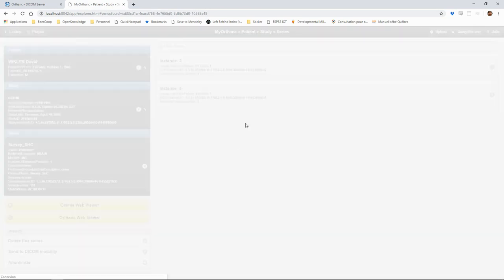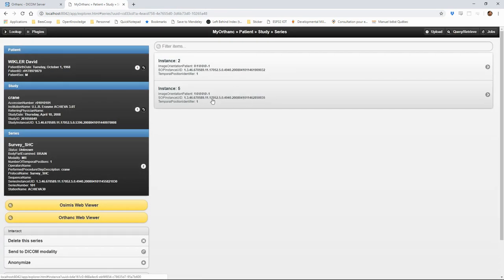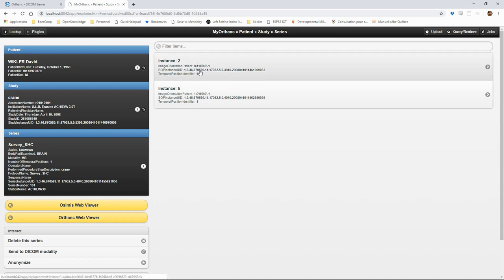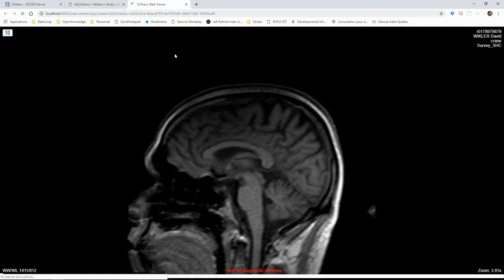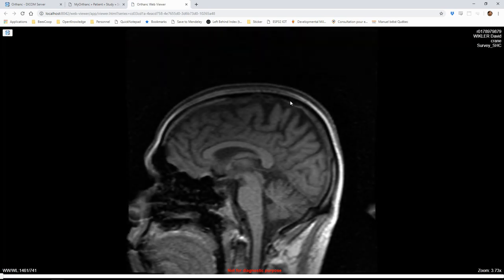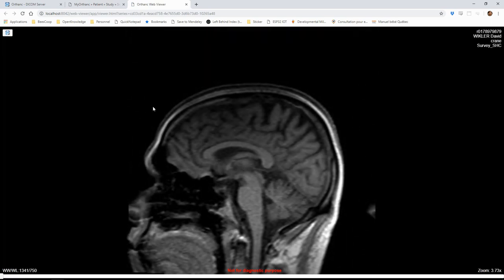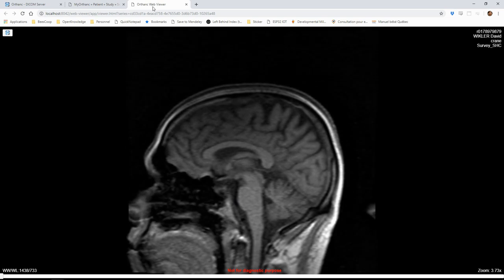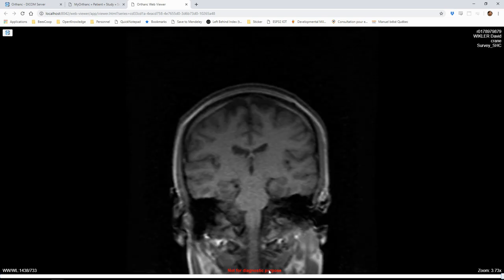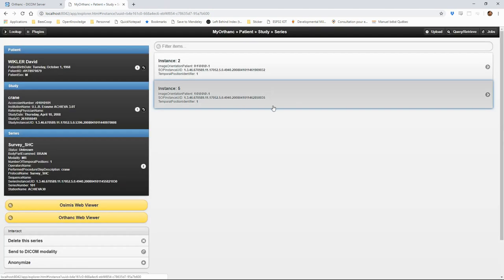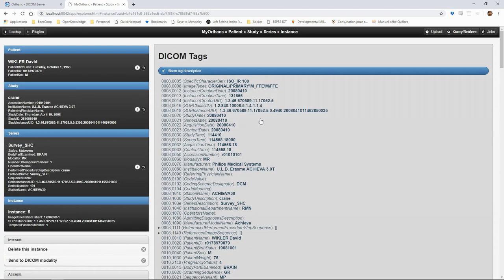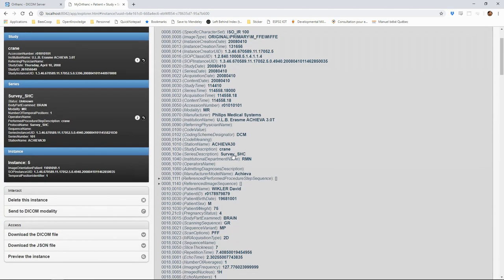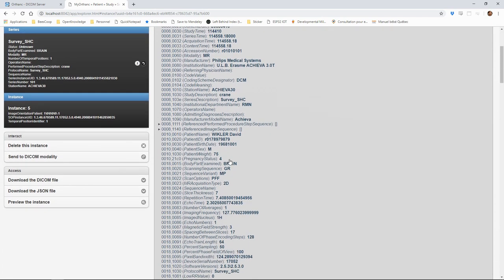At the series level, we also have access to the more basic Orthanc viewer which has less functionality. At the instance level, we can see all the DICOM tags for the file as we would by executing the DICOM dump command.